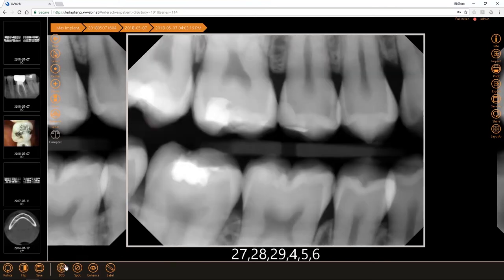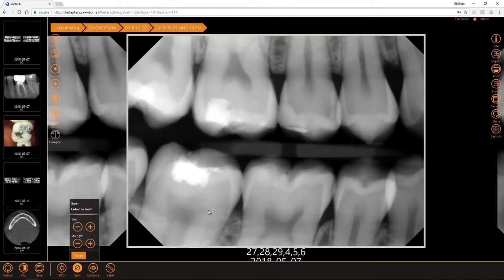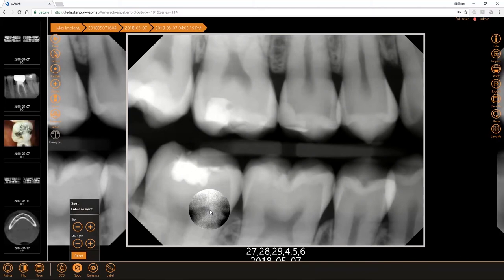The next tool we have is a spot enhancement. The spot enhancement applies a circle on the x-ray that magnifies the brightness and contrast within that circle.